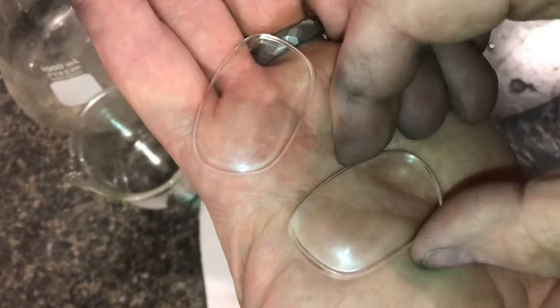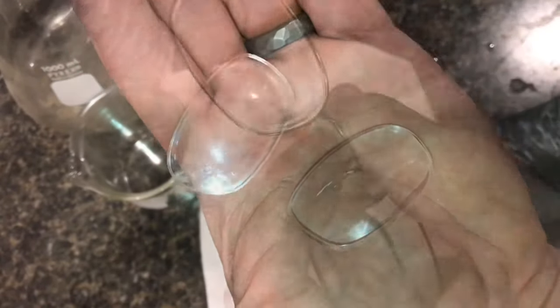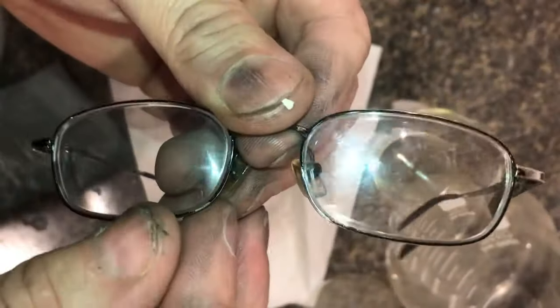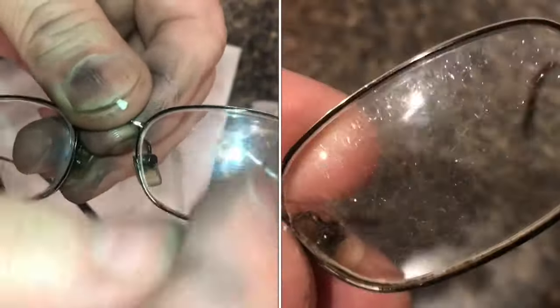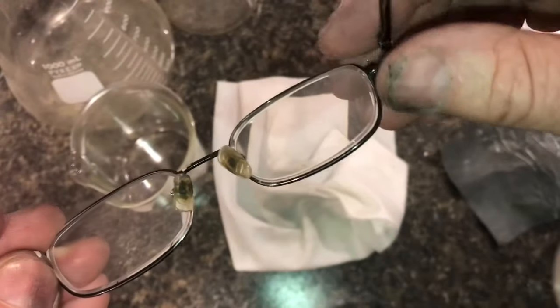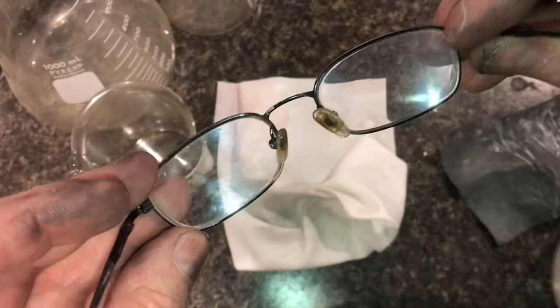Now this is a side-by-side comparison. This is the one that I've cleaned and polished, and this is the one that I have only removed the coating from. I'll put both lenses in so you can see them side by side. This one has just had the coating removed, and this one has been cleaned and polished, so you can see the difference. Here it is from the other side — this side has been cleaned and polished, and just the coating removed on this side.